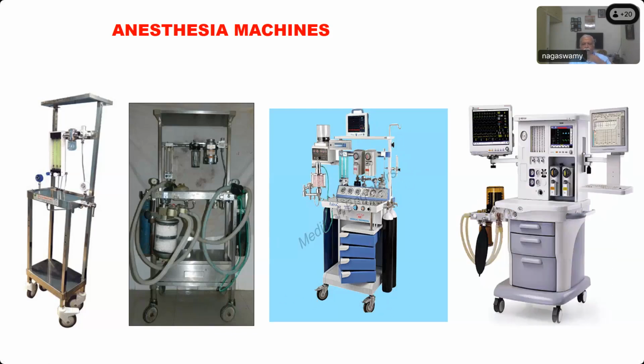And here we come to the more latest version of it, and you find all the other things fixed there, but you find everywhere it is covered, and you don't find any provision for fixing the cylinder, but you have to go at the back and see there will be a cylinder fixed in that.